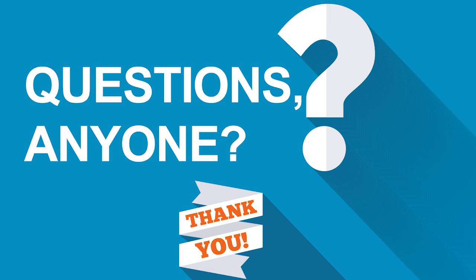Thank you. That's a good question. One of the things that you have to have in making stool examinations, it's very important to have an eyepiece that is fitted with a micrometer that you can use to measure the objects that you see, because the size of objects is very important in distinguishing parasite eggs from artifacts. Then again, you also have to look at the internal structures. And as I pointed out, in the case of pollen grains, the color might be different.